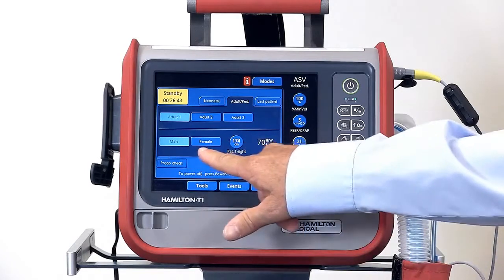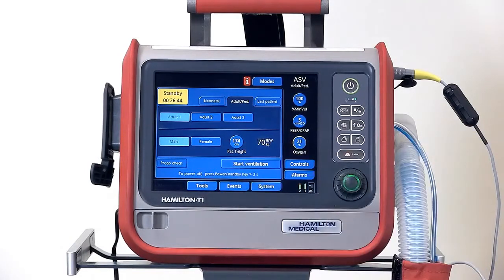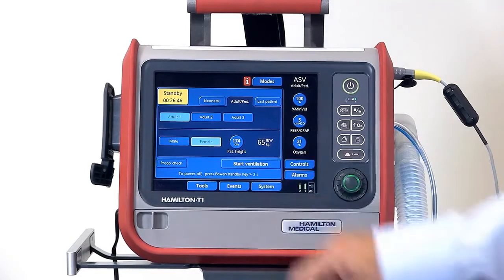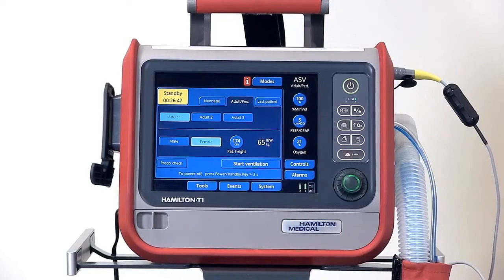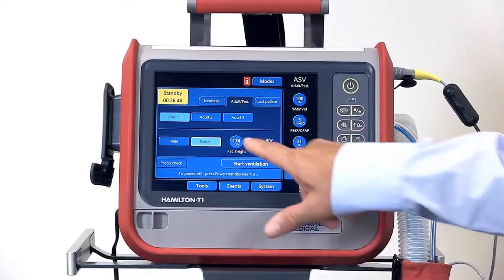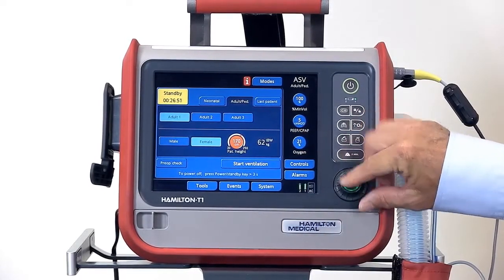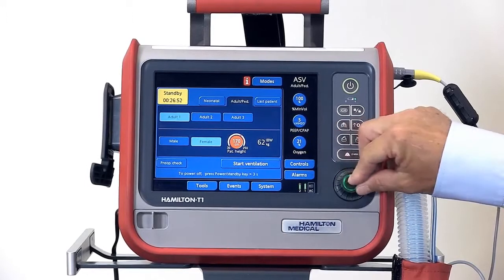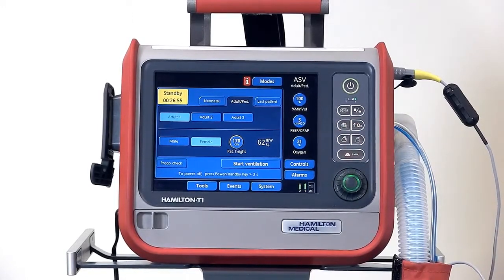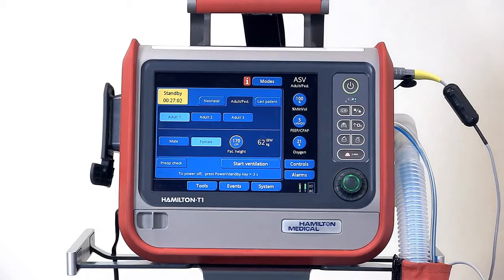Down here, you'll want to put in the patient information. Select male or female and dial in the patient's height. This allows the ventilator to automatically calculate the patient's ideal body weight, which is used for some initial ventilator settings and alarms, and also is used in ASV mode.